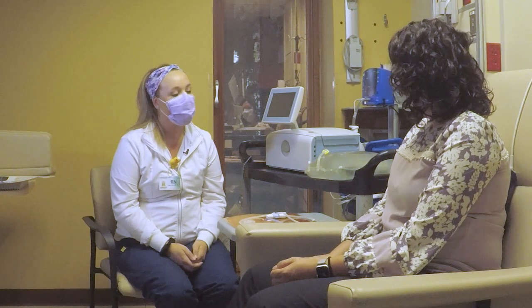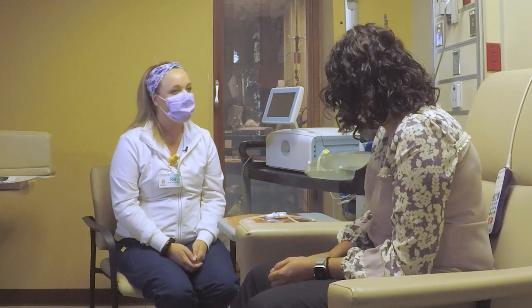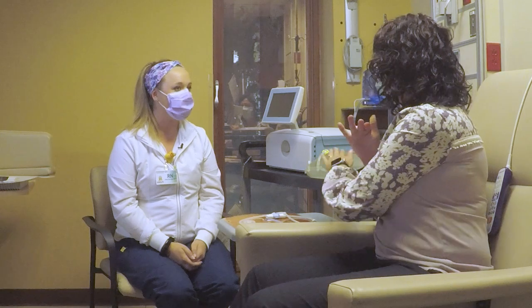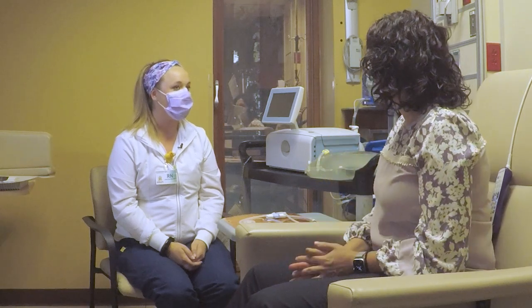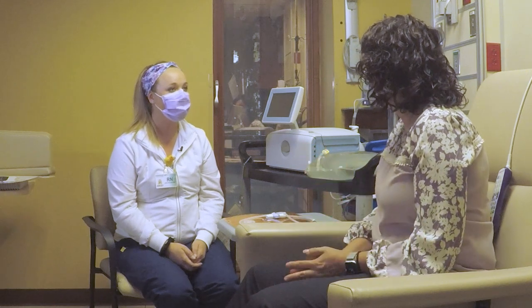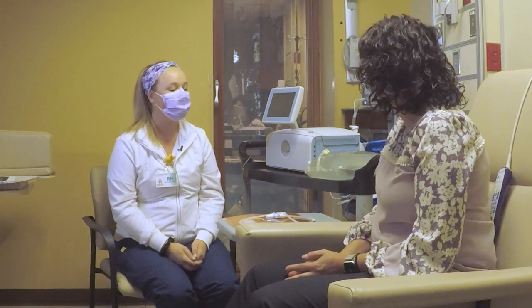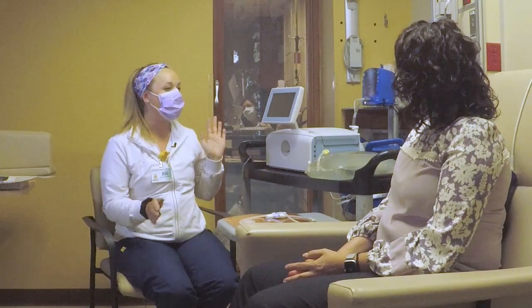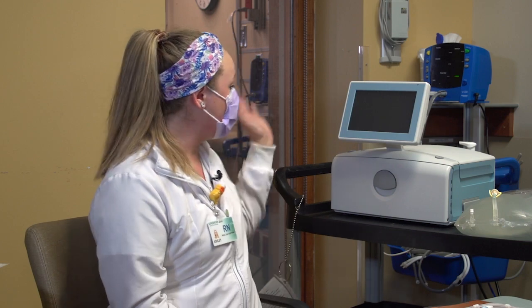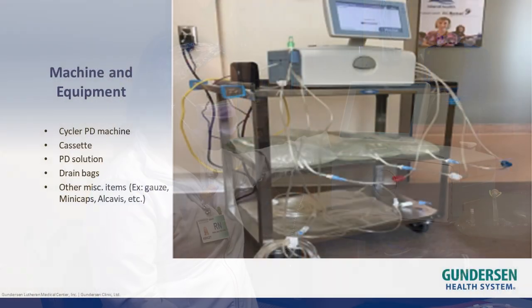Okay. So it looks like I need some space for supplies, I guess. And where does the fluid drain when it drains out of my peritoneum? I guess what are some of the things I need at home to be successful? Yeah, so we will be able to help with setting up supplies and supplies being shipped to your home during treatment. But one of the biggest things that we're going to need is the machine.